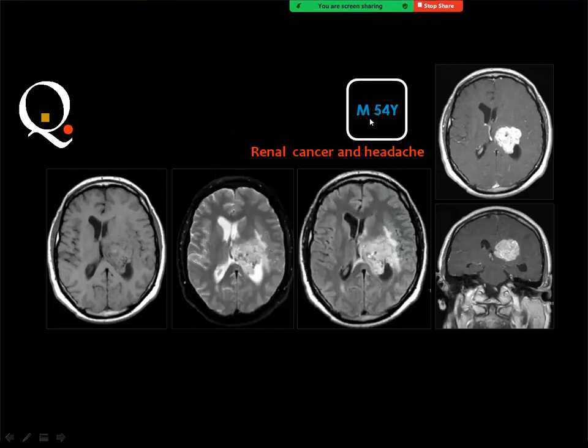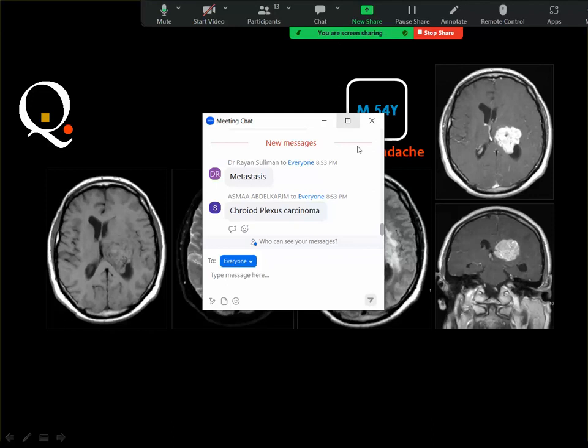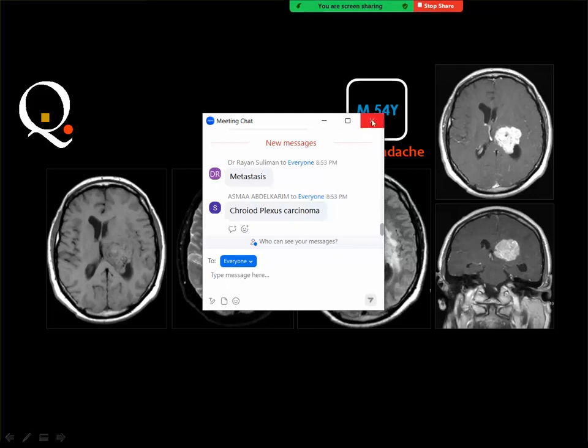Yes, of course, you have the right to diagnose this as metastasis because you know that the patient had a primary malignancy. But you should know that even in the presence of a known primary malignancy, the patient may have other lesions that are benign.